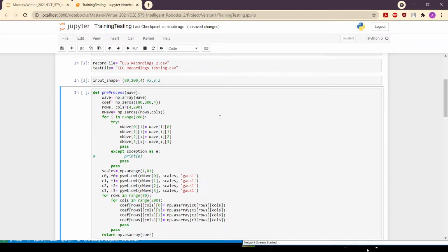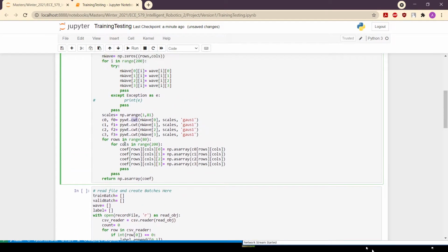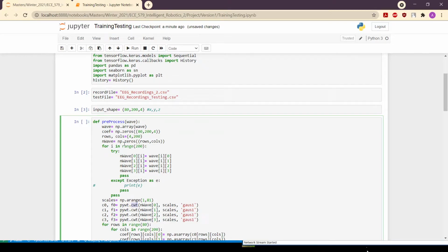This is a pre-processing function I've written, which pre-processes the waves to have a 3D plot. What this function does is a continuous wavelet transformation for each individual electrode. So we will pass the 2 second wave for each electrode, and it will separate them and perform a continuous wavelet transformation for the recording, and we will get a time-frequency analysis of that wave, and it will return that 3D plot back to where the function was called.